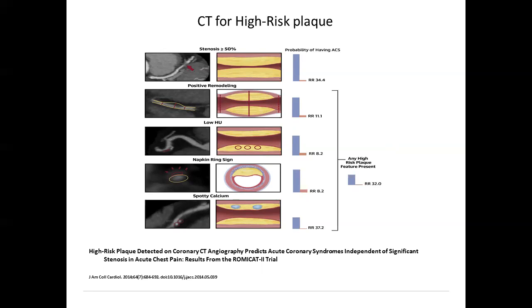Spotty calcification. I don't know if any of you were at my calcium scan talk, but now we are starting to realize that all calcification is not the same. Because now we are finding out with statins your calcium actually goes up, which doesn't make sense because we know statins stabilize plaques. So now we are starting to realize that calcification is different. Spotty calcium, where you have little calcium spots in the plaque, is bad. That's a marker of unstable plaque, versus your calcium score calcium, which is dense calcium, which we think is more the burnt out stage of the plaque, which seems to stabilize it.